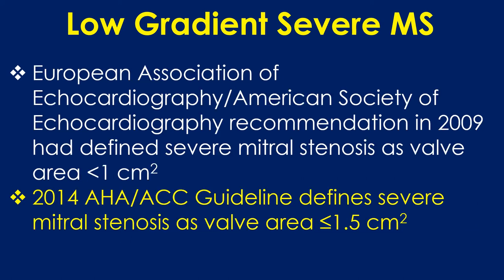European Association of Echocardiography and American Society of Echocardiography recommendation in 2009 had defined severe mitral stenosis as valve area less than 1 square centimeter. 2014 AHA-ACC guideline defines severe mitral stenosis as valve area less than or equal to 1.5 square centimeter.